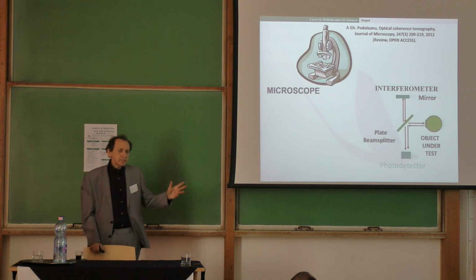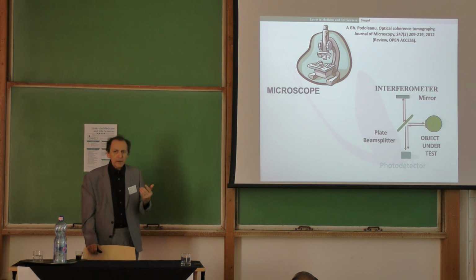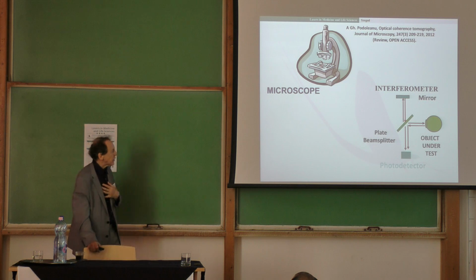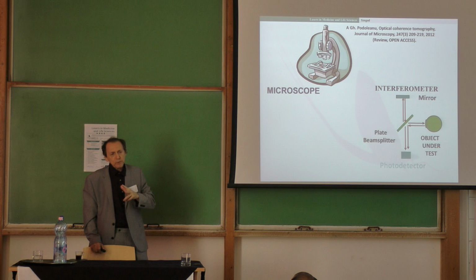the time domain is something which we also teach to our second year physics students, because that's the basis of OCT, and that's the way the first OCT was produced, using time domain. However, time domain is still used in microscopy OCT. It's less and less used in medical applications, and you'll see immediately why. So now I'm going to explain the other 2 types of OCT.